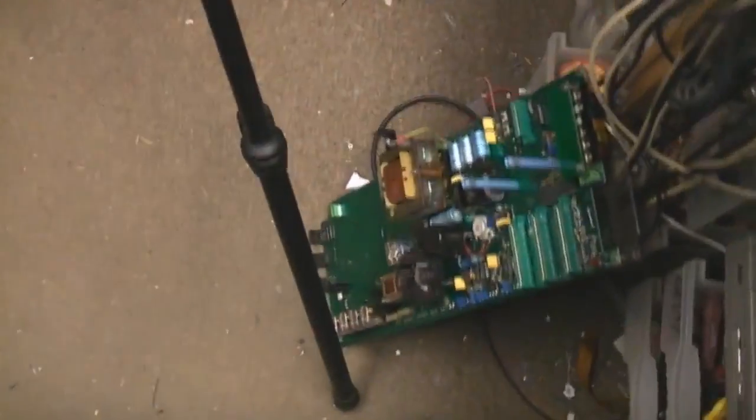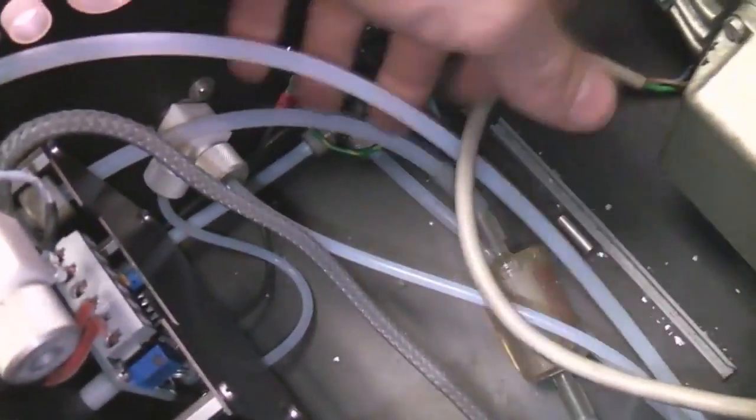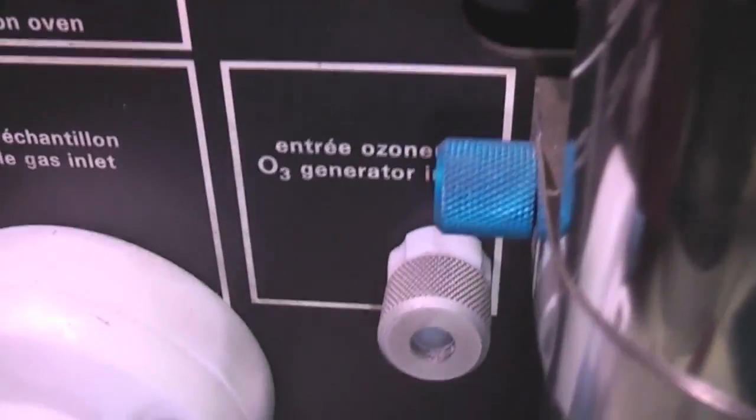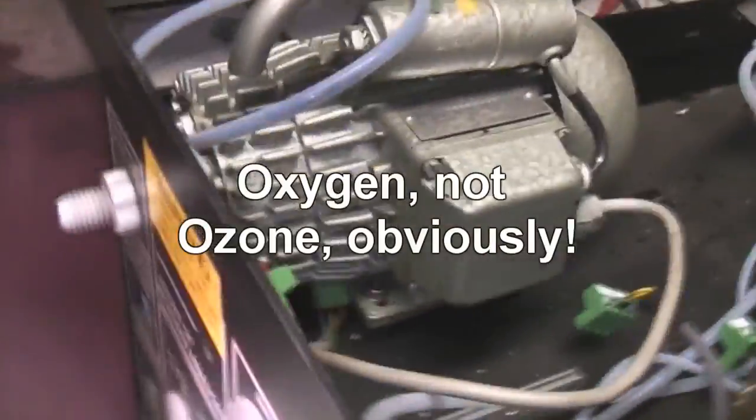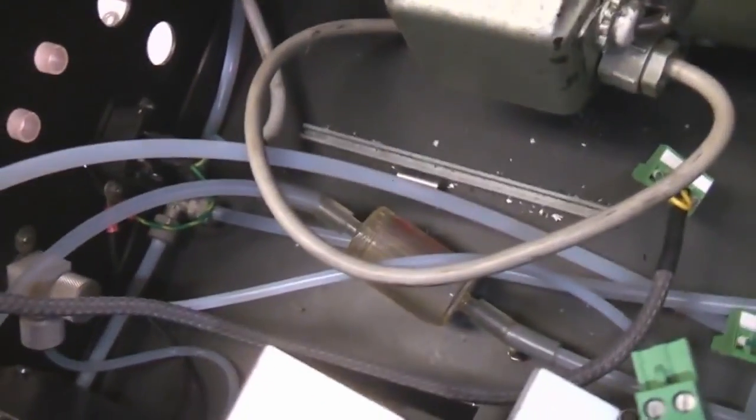With that huge electronics board out the way, we can now get a closer look at what's in here. This is the vacuum pump. The plumbing on this doesn't quite correspond with the manual, so I think this is probably a slightly different version. We've got the inlet to the ozone generator, so it's got its own dedicated input. I'm guessing this would normally be fed with air, but if you're trying to detect tiny concentrations of gas, the last thing you want is contamination going into your ozone generator, so maybe it can be fed via a high purity source or a bottle of oxygen.